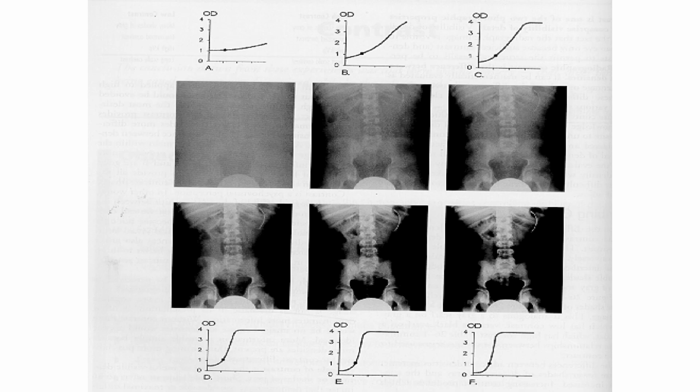Okay? However, yung pelvis, hindi siya masyadong visible. Yung pelvis. Di ba? Okay, if you are going to ask me which image has the best contrast, my answer is letter C. Okay?